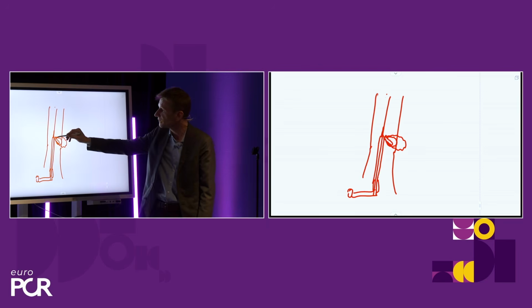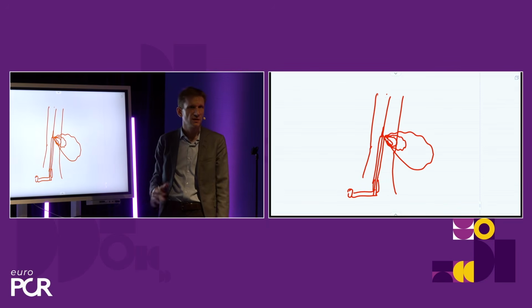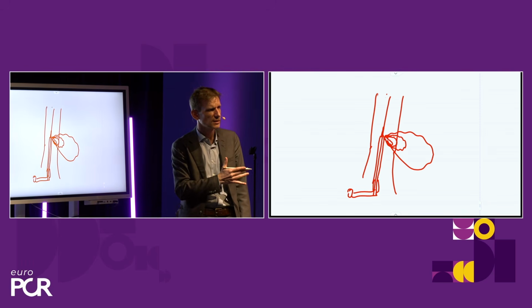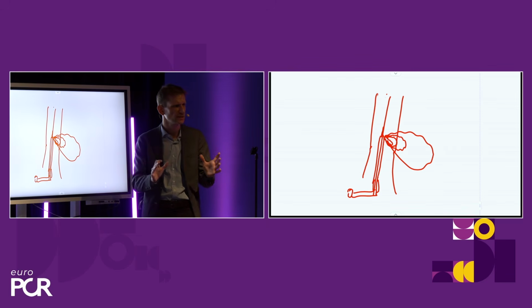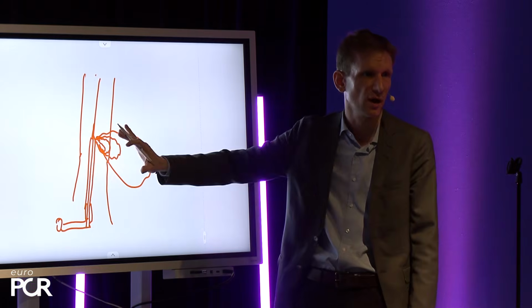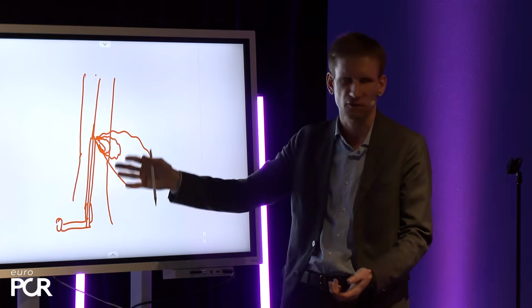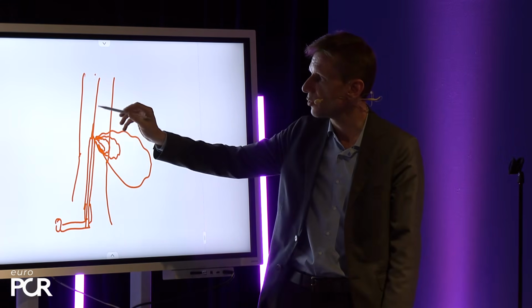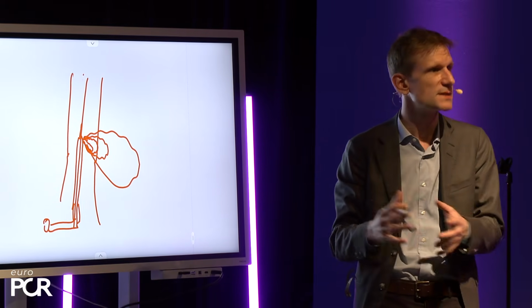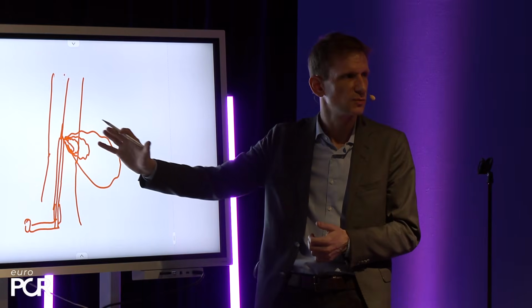And if you have a massive disaster there, where you don't have any closure and you see a massive bleeding, there are some reports now. I know Mohamed Abdelwahab from Leipzig reported a series of 60 cases or so where you have a complete failure. It's going to be hard to go on with suture-based control because you have complete failure. Then at that moment you can go with, for example, a larger plug-based device like a Manta as a bailout. We kind of only use it still as a bailout because then there are techniques to position it.